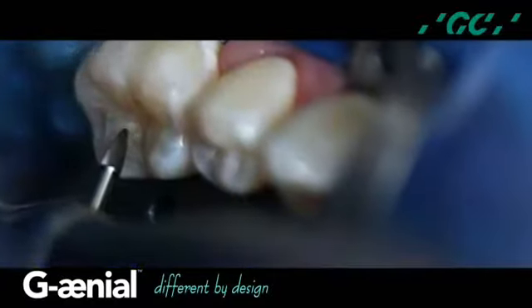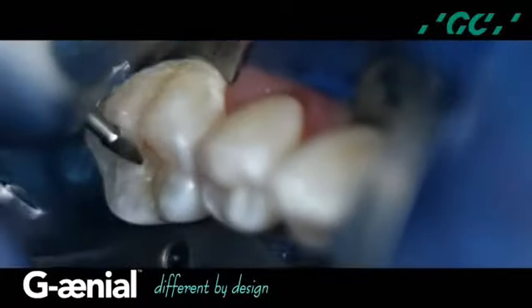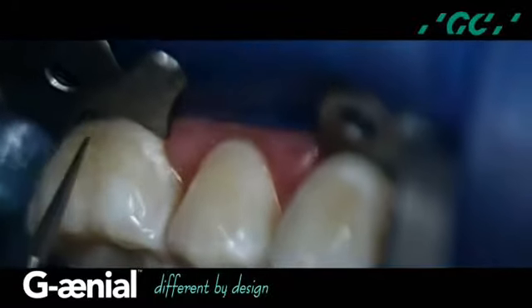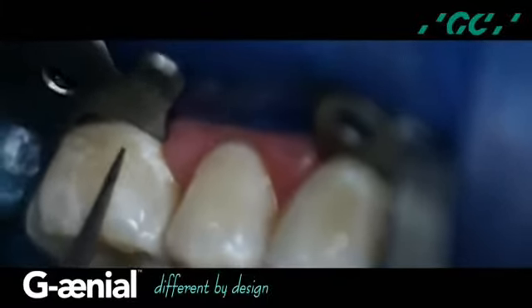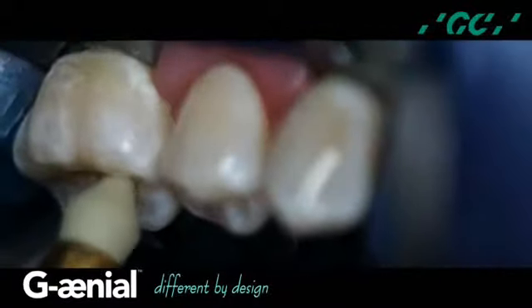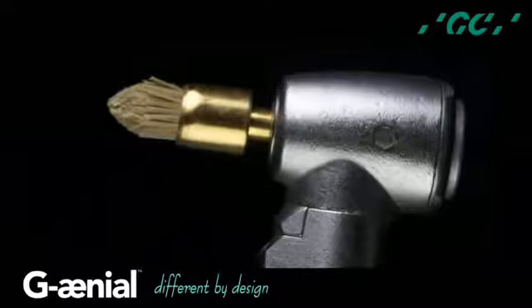Finishing is accomplished with a 30 fluted H274 tapered finishing burr by Brasseler. Notice the shape follows the occlusal anatomical contours. The buccal surface is contoured and smoothed with a 30 fluted DET9 needle-shaped finishing burr by Brasseler. A silicone impregnated brush, a Composite Pro by Brasseler, is used to enhance the smoothness.